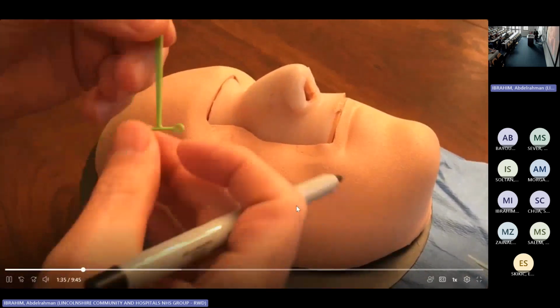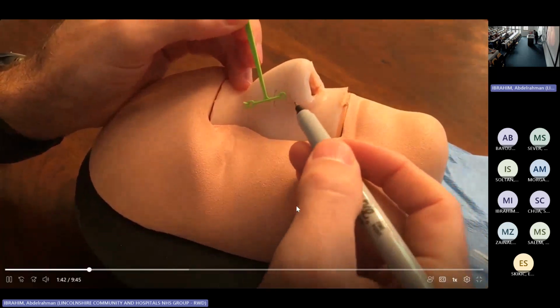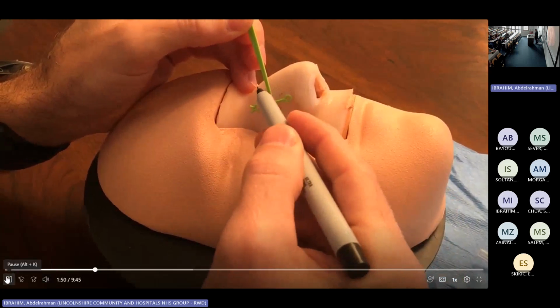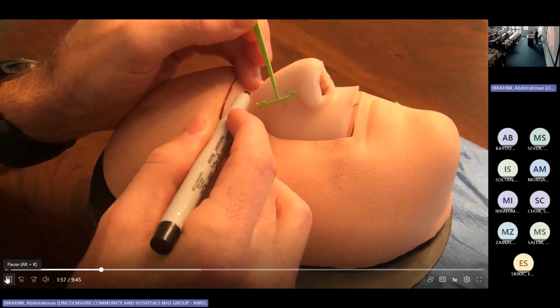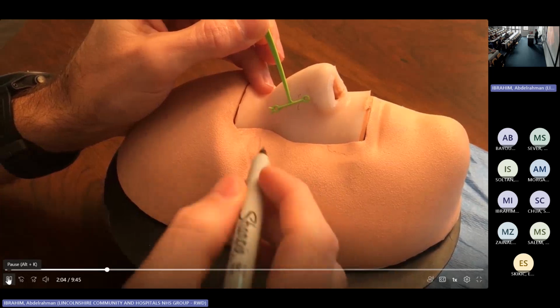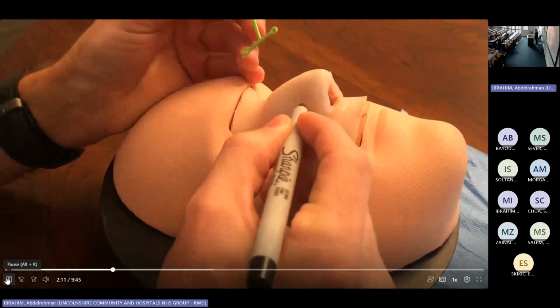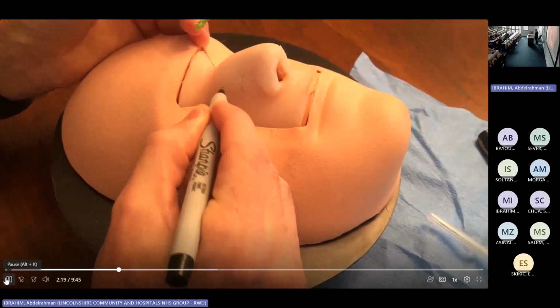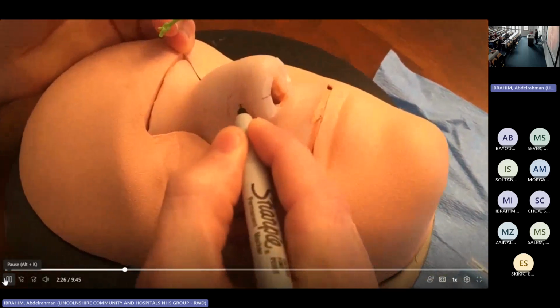And then I position my positioning guide over the anatomy. I will want to be cephalic to the superalar crease by 1 or 2 millimeters, parallel to the dorsum, and the distal forks will be over the nasal bone, mid-radix, mid-medial canthus. So this position looks good right here. I will make 3 marks: my distal mark, my proximal mark, and I'll place a 3rd mark on the rim of the ala in line with my other 2 marks.